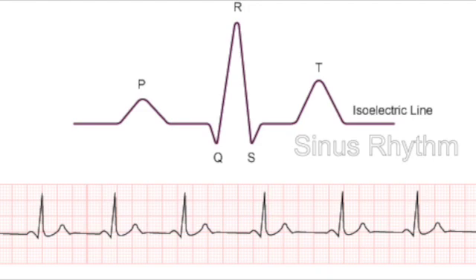All right. So on the screen now should be a picture of an EKG, or a rhythm strip along the bottom with a very normal appearing sinus rhythm beat. Yeah. But when you talk about normal sinus, we can talk about it in ranges. So we talk about sinus Brady. Yep. Which we know Brady is less than 60. Yes. We talk about normal sinus, the rate of 60 to 100. Correct. And we talk about sinus tachycardia, which is going to be anything above 100. Right. Still coming out of the SA node.